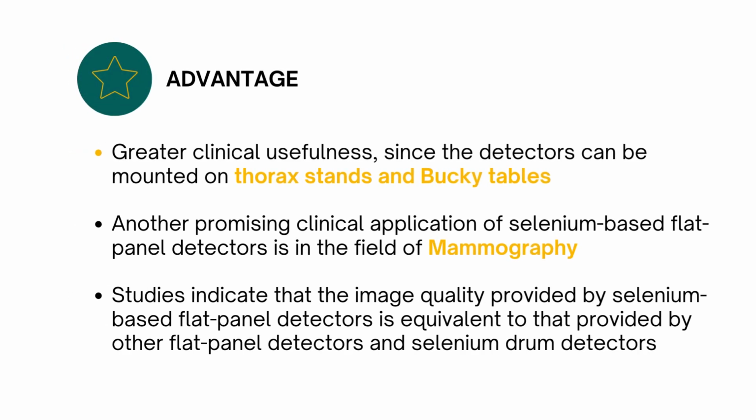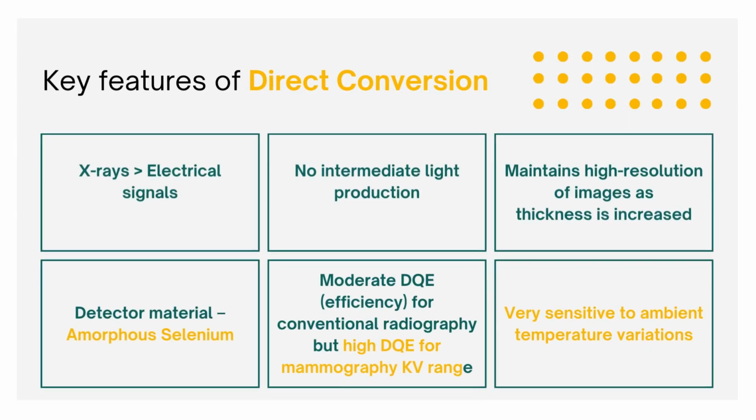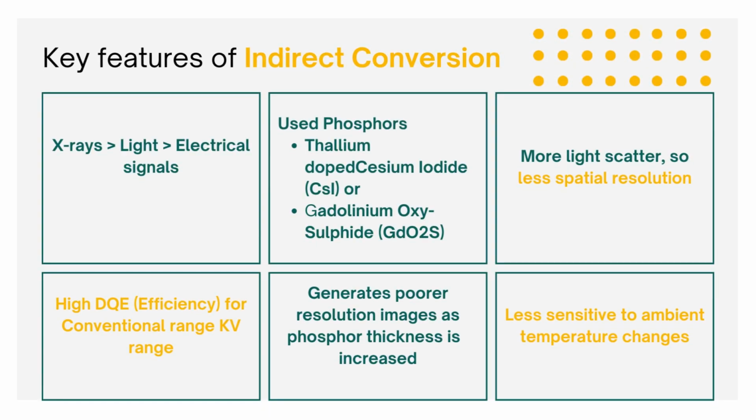Another promising clinical application of selenium-based flat panel detectors is in the field of mammography. Studies indicate that the image quality provided by selenium-based flat panel detectors is equivalent to that provided by other flat panel detectors and selenium drum detectors. In summary, we have some key features of the two types of detectors in digital radiography.